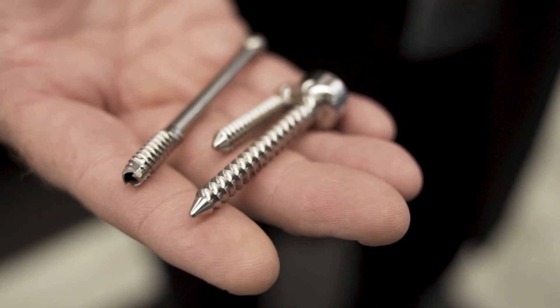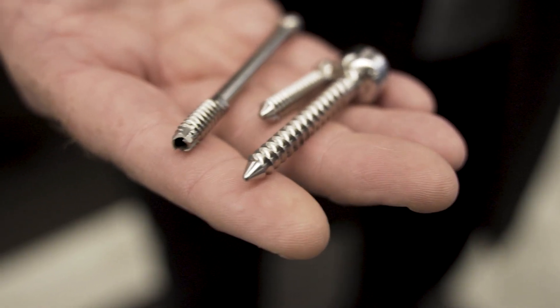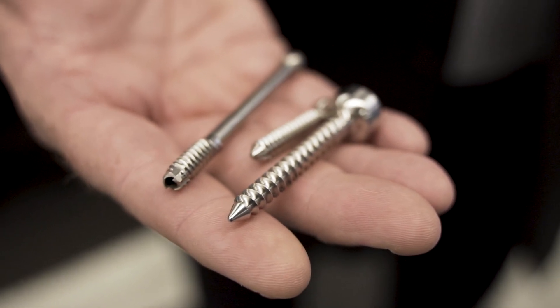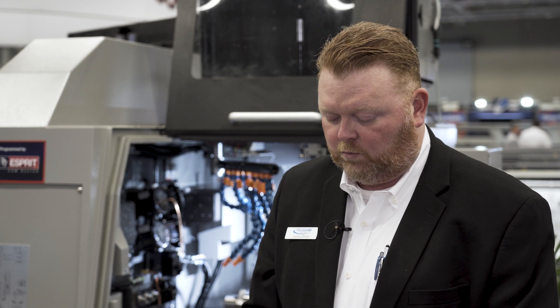One of the challenges in medical device manufacturing is how to cut threads on bone screws. Because of the geometry of the screws, the cutting is challenging for more conventional threading methods like single point threading. So what most medical device manufacturers use is a process called thread whirling.